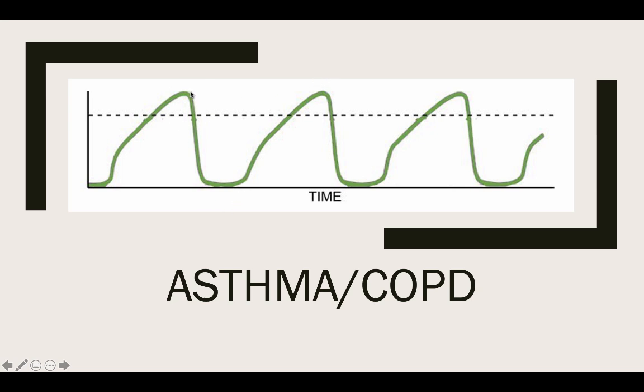So their end tidal CO2 is up here. It's above this 40 line, right? So CO2 should be 40. Let's say that's our happy number. CO2 is 40. We're up here, right?